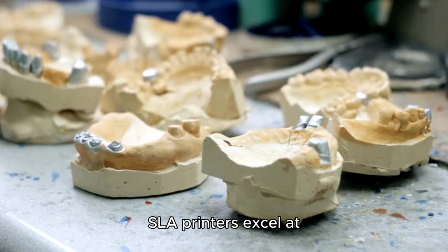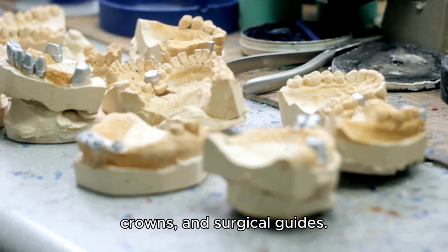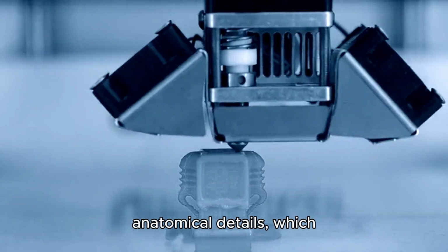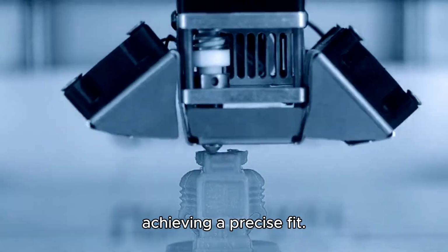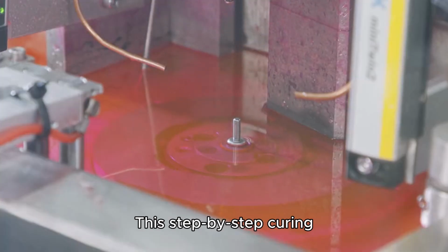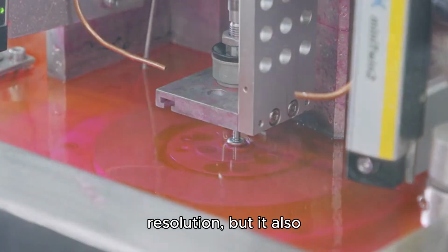SLA printers excel at creating highly detailed items like dentures, crowns, and surgical guides. The high-resolution output of an SLA printer means we can capture tiny anatomical details, which is essential for achieving a precise fit. Here, you can see an SLA printer curing each layer meticulously. This step-by-step curing is what gives SLA printers such a high resolution.